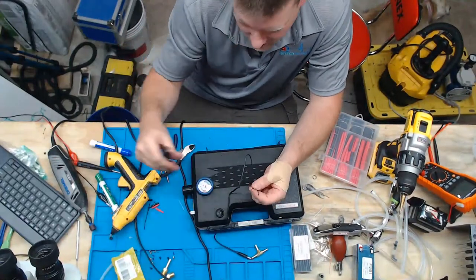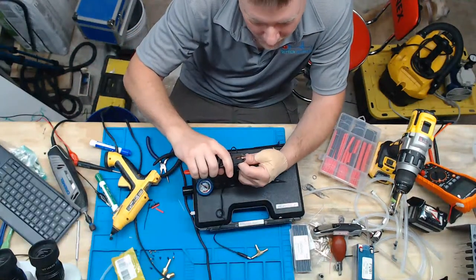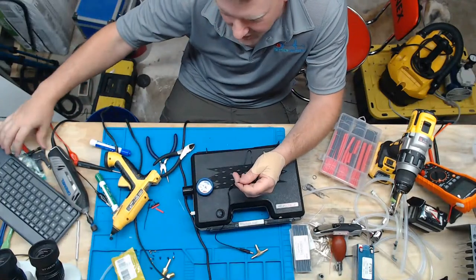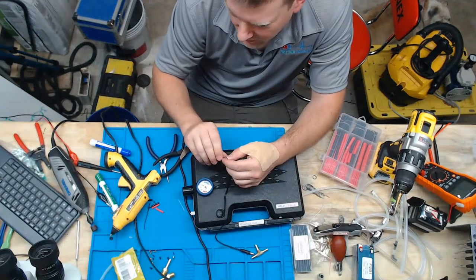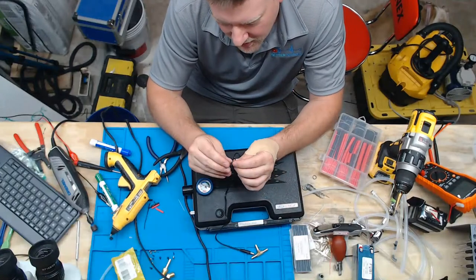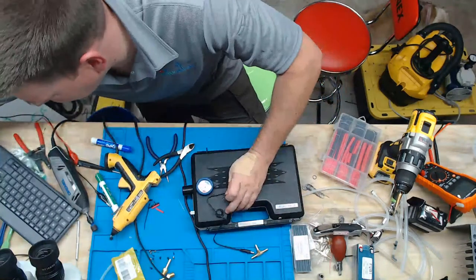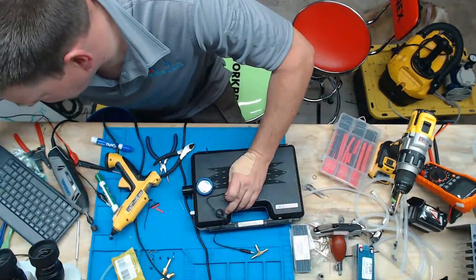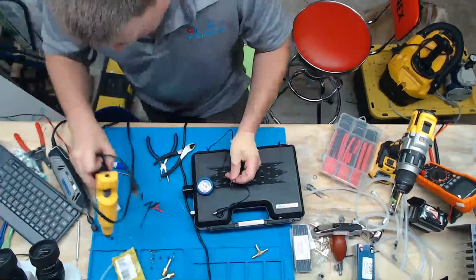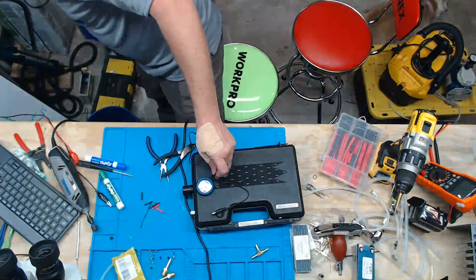And I have right here my regulated DC power supply. So we can hook it up and I can throw 3 amps at this guy. And 3 amps, that's some juice, man. Let me tell you. You know, I have a notebook adapter right here, but it doesn't have the correct power port on it. But I have a BK Precision regulated power supply. This is where it's at, guys. Here, let me shut off my irons. And let's get rid of the hot melt glue gun. I got so much stuff that's sitting here. All right.